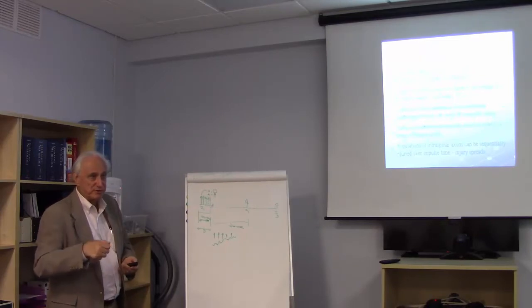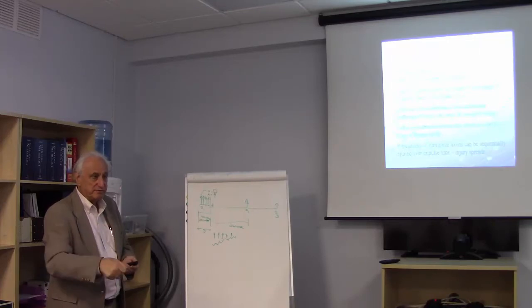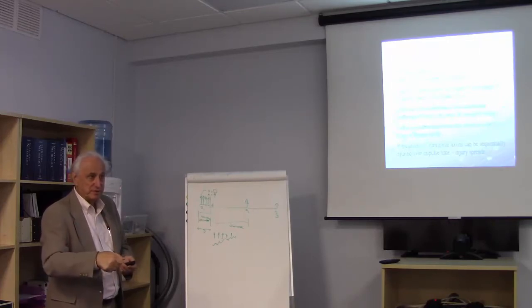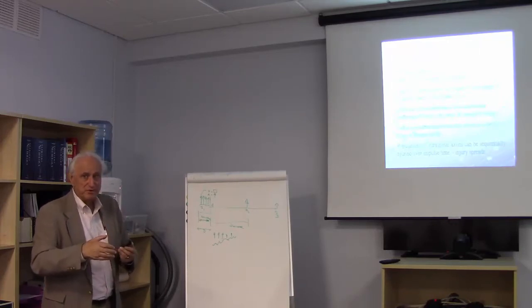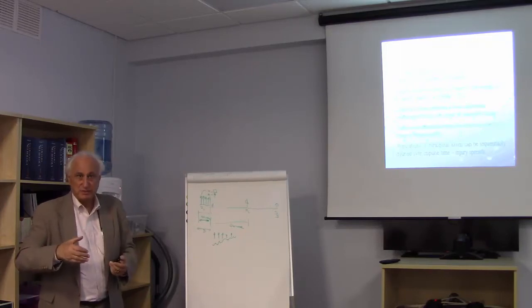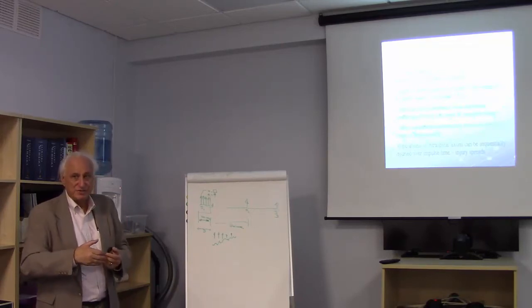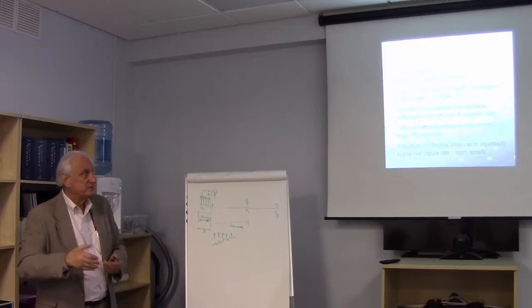And at the end point, you can produce a significant trauma, or you can hit the nerve rapidly with an instrument. Okay. So the degree of trauma at the end point may be the same, but what you're going to see physiologically as the trauma is happening is different.